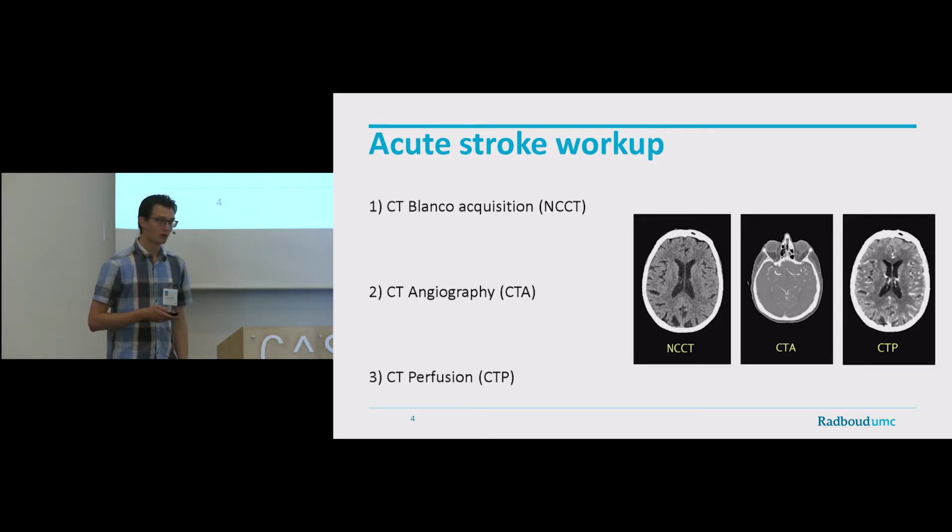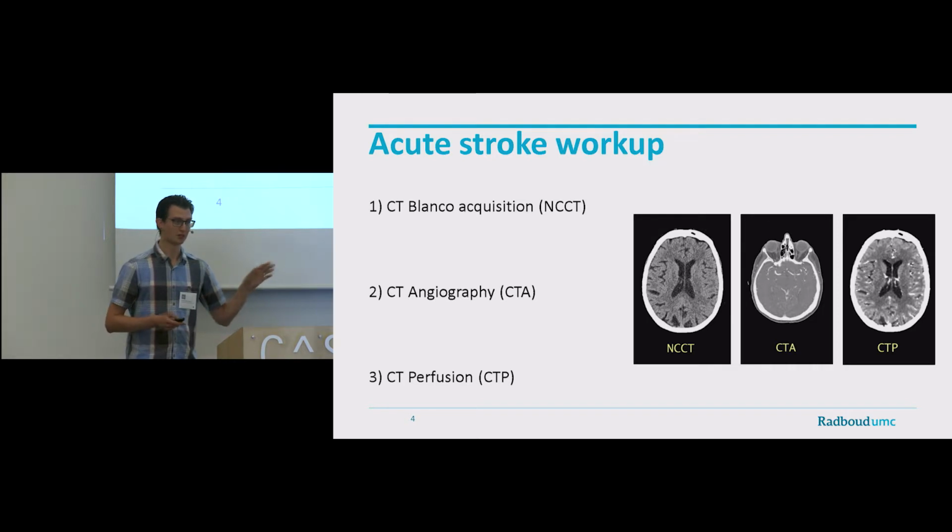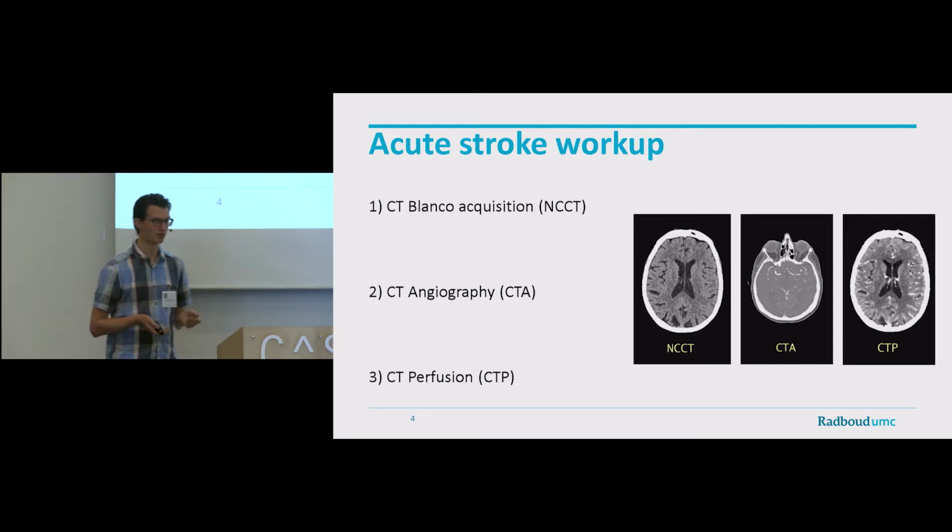And that could be useful. Why would it be useful? Because every one of those scans induces some radiation. CT is known for its ionizing radiation, and you typically want to reduce that as well. It reduces the damage to the patient, but also costs, because you can simplify the workup if you only have to do one scan, and that's also a good benefit.